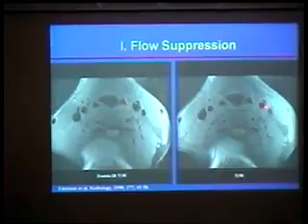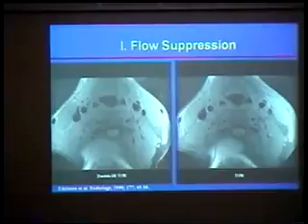The reason why this region is so difficult to suppress is, if you know a little bit about flow dynamics of the bifurcation region in carotids, this is the region where the flow tends to be circulating rather than a streamline flow through. There's a region, especially at the carotid bulb shown here, where the flow becomes stagnant and circulates within the region. In MR, this is a tremendously challenging place for getting true flow-suppressed images. And at this moment, it seems that the effective way of doing this is to use double IR flow suppression.